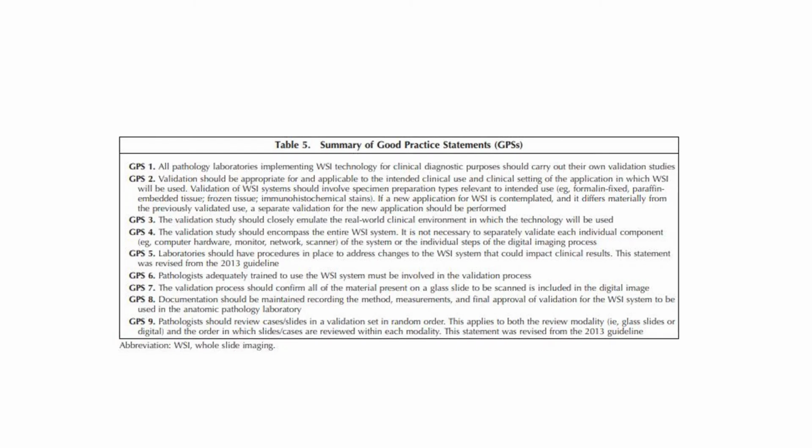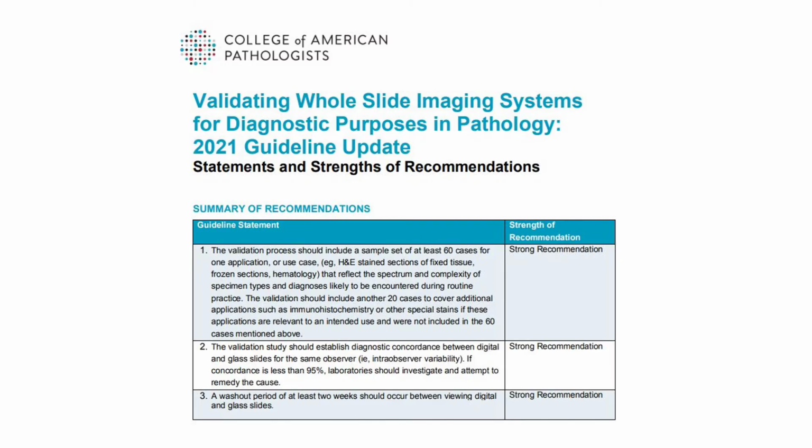This is a table from the publication and shows the newly updated summary of good practice statements. Based on the new updated recommendations, the College of American Pathologists issued recommendations for validating whole slide imaging systems for diagnostic purposes in pathology. The guideline statement includes 3 recommendations.